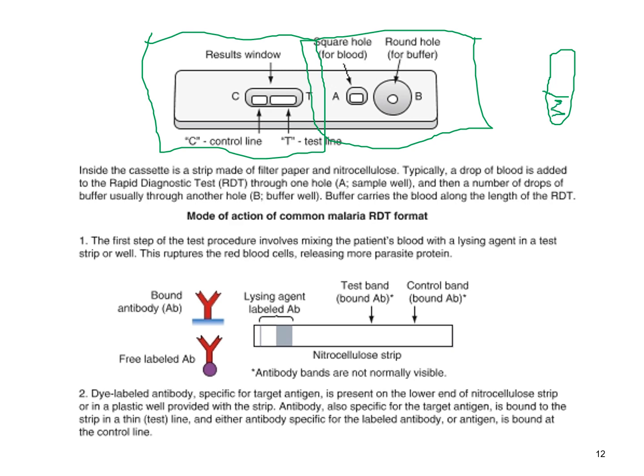So they're all a little different, so you will definitely want to be sure you read your procedure. So in the first step, actually let me point out here, they flipped this test strip. So up here, your sample goes towards the right. Here, this is our sample reaction area that's going to take place, where this end down here is more of our detection area, where you're actually going to have those antigen antibody complexes take place.